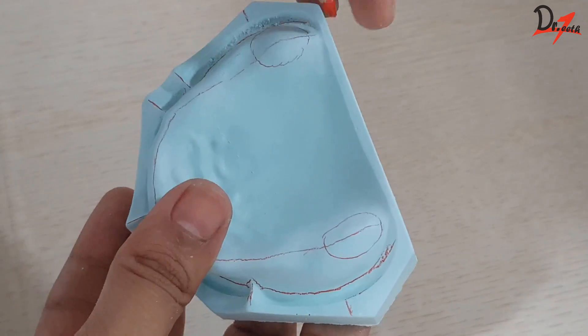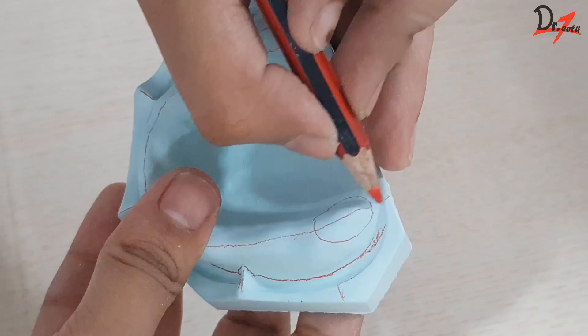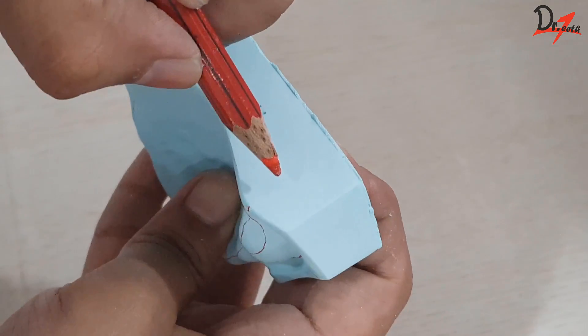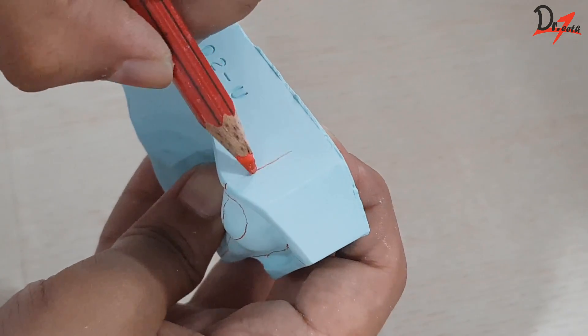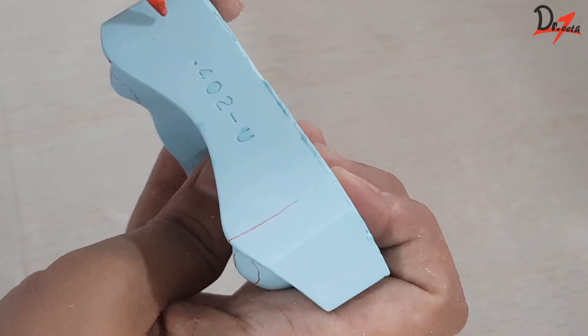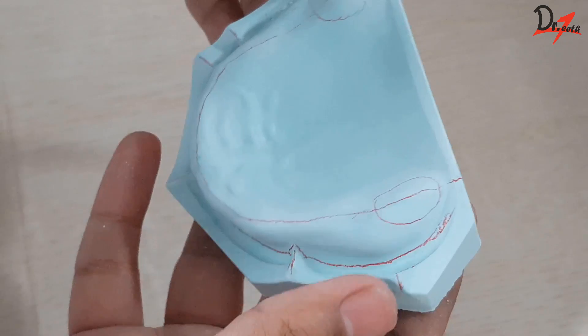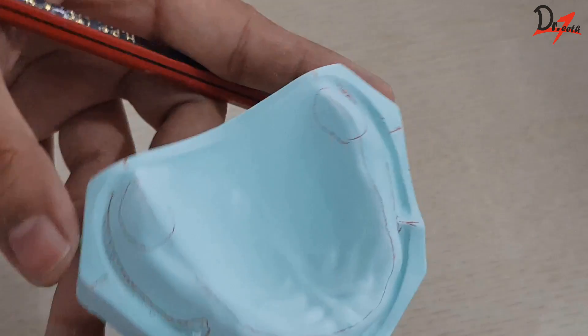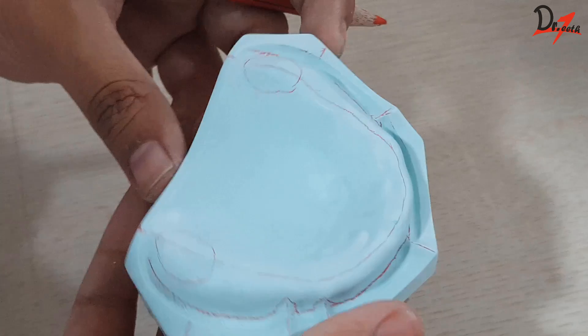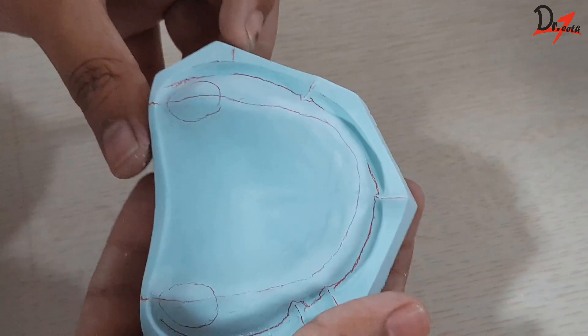Then extend the crest of the ridge line on the posterior surface and on the posterior cast. So this will help us during articulation. Also, this line will help us during making of the occlusal rim as well as during teeth setting, as we will see in the upcoming videos.